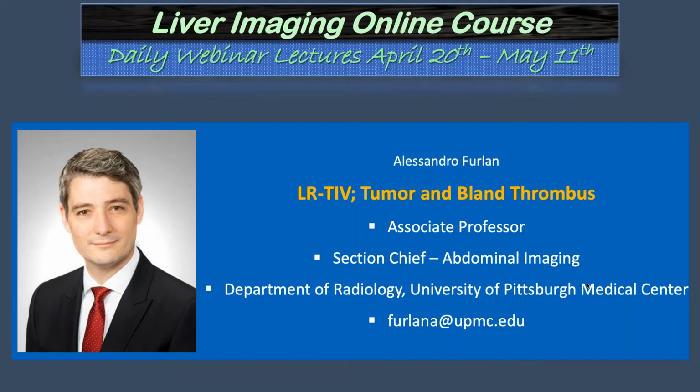What it feels like is that it depends on the extent of the thrombus. Even if it's lobar or segmental involvement, things become different. For segmental PVT, we see that sometimes they just resolve, like we don't see them at all. And in lobar, sometimes I feel like there is some sort of disappearance of enhancement. And in a few other patients, we will have to depend on the diffusion weighted imaging. So it's kind of confusing, but just as you mentioned, if we have to pick one, I agree with you about the enhancing.